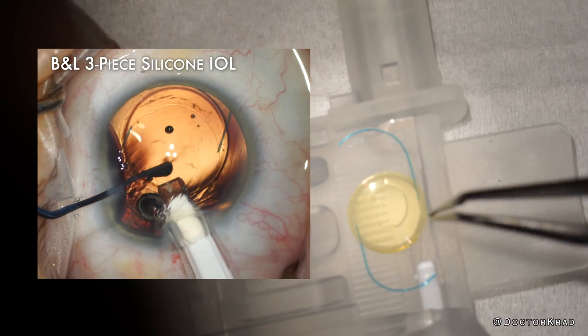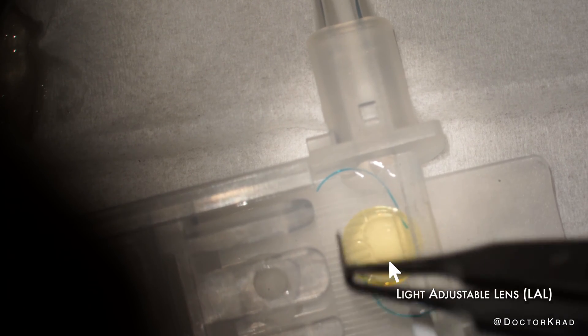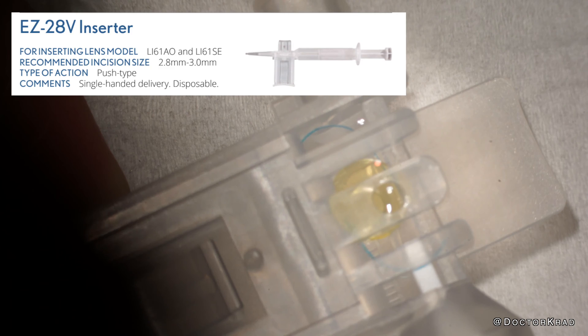Today I wanted to test the BNL injector with the light adjustable lens. This is the EZ28 injector made for Bausch & Lomb lenses. It's not made for the RxSight light adjustable lens, but I'm going to try to inject it through this injector to see what happens.